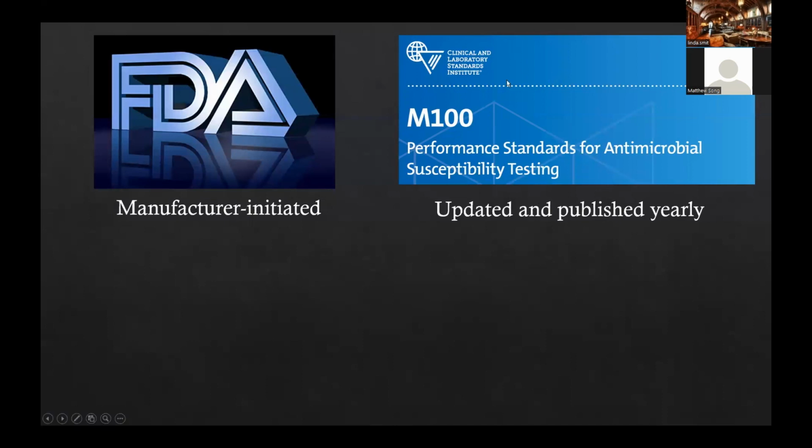What we all tend to live by in microlabs is CLSI again. This document is published every year, usually in January. COVID kind of threw it off a little bit, but it's updated and published yearly. And this contains tables with all the breakpoints that are determined by CLSI.